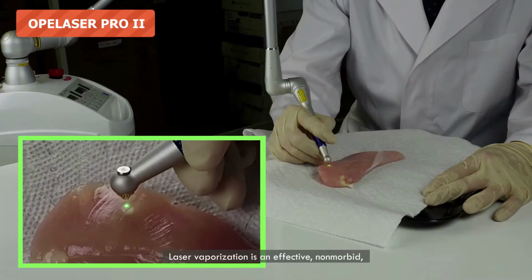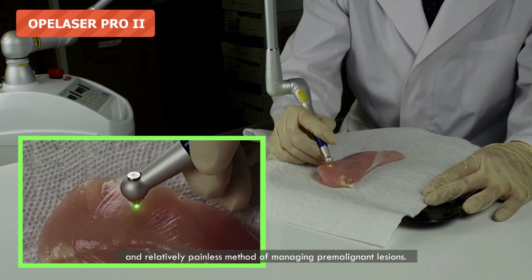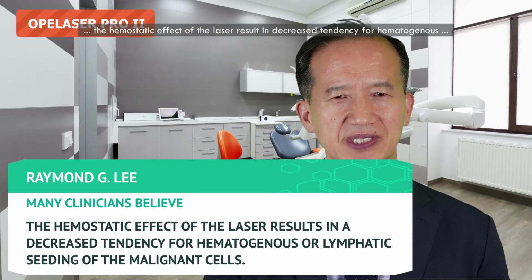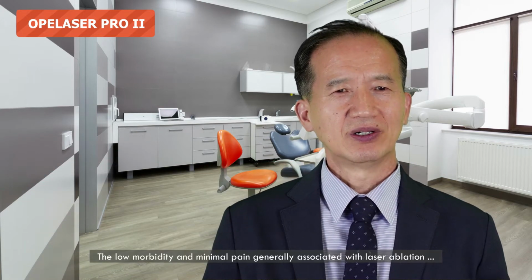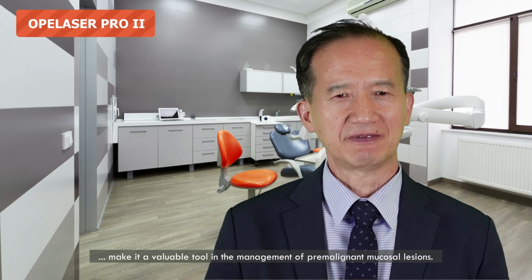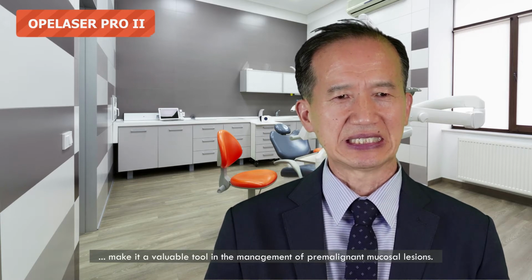Laser vaporization is an effective, non-morbid, inexpensive, quick, and relatively painless method of managing premalignant lesions. Many clinicians believe that the hemostatic effect of the laser results in decreased tendency for hematogenous and lymphatic seeding of the malignant cells. The low morbidity and minimal pain generally associated with the laser ablation make it a valuable tool in the management of premalignant mucosal lesions.